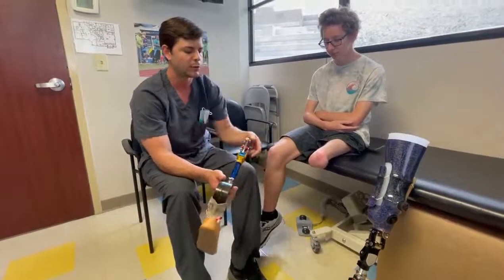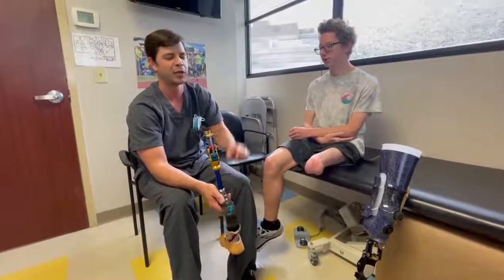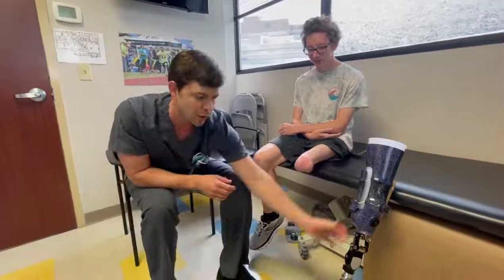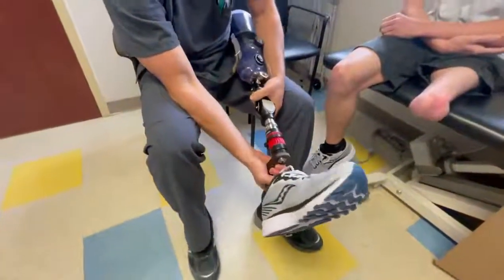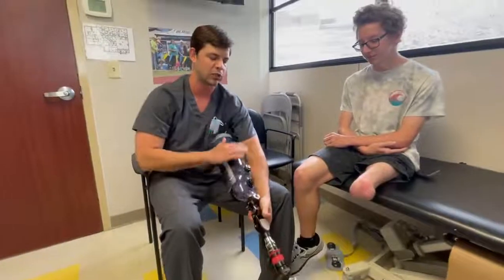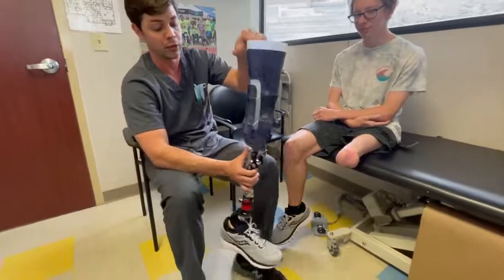He's been doing really well, but he's gained some weight and is now a junior in high school, so he's back in town for a tune-up and we transitioned him to adult components. This is the All-Pro DS, which allows torsion — he's liking it. It's a little heavier, but getting torsion function out of a foot to decrease stress and shear forces on the residual limb and proximal joints is a good thing. We also transitioned him to an adult total knee.